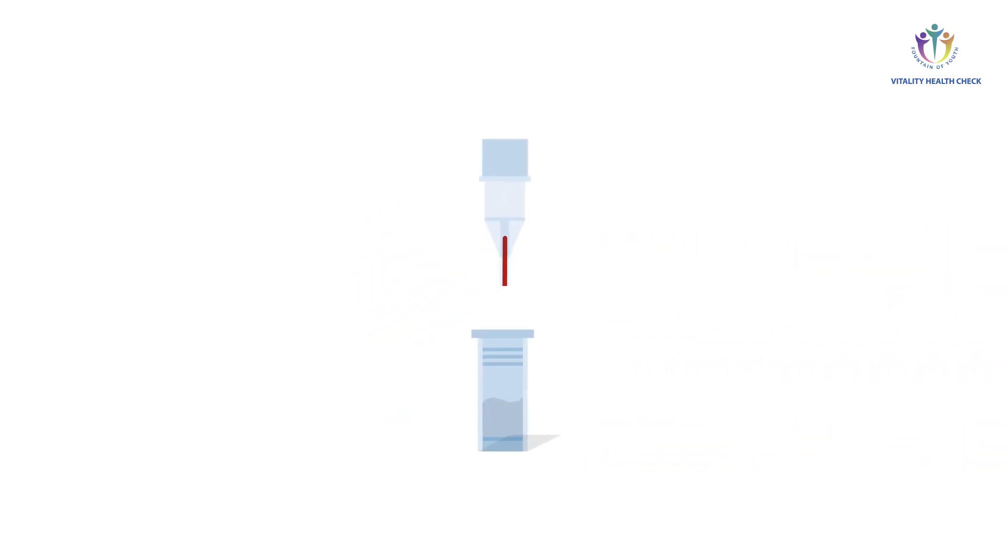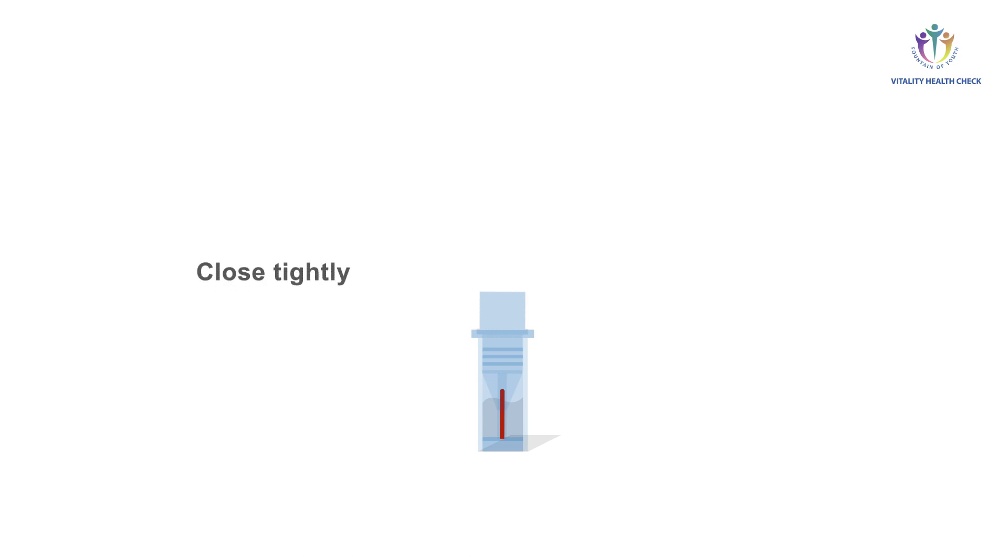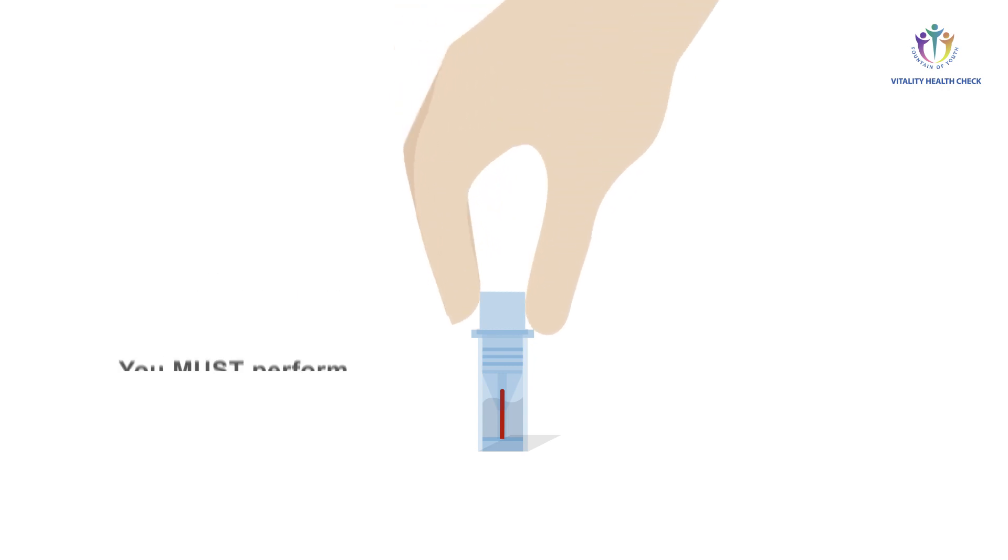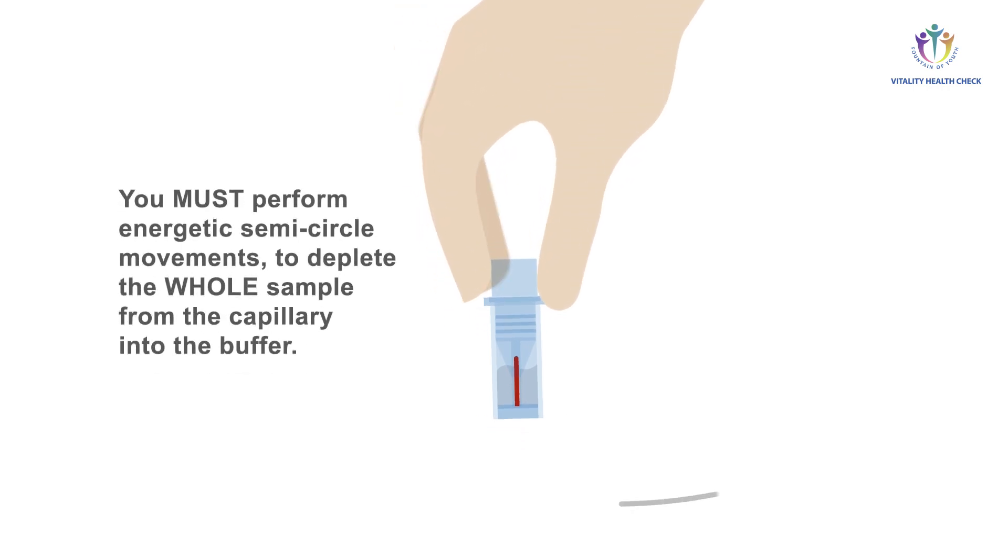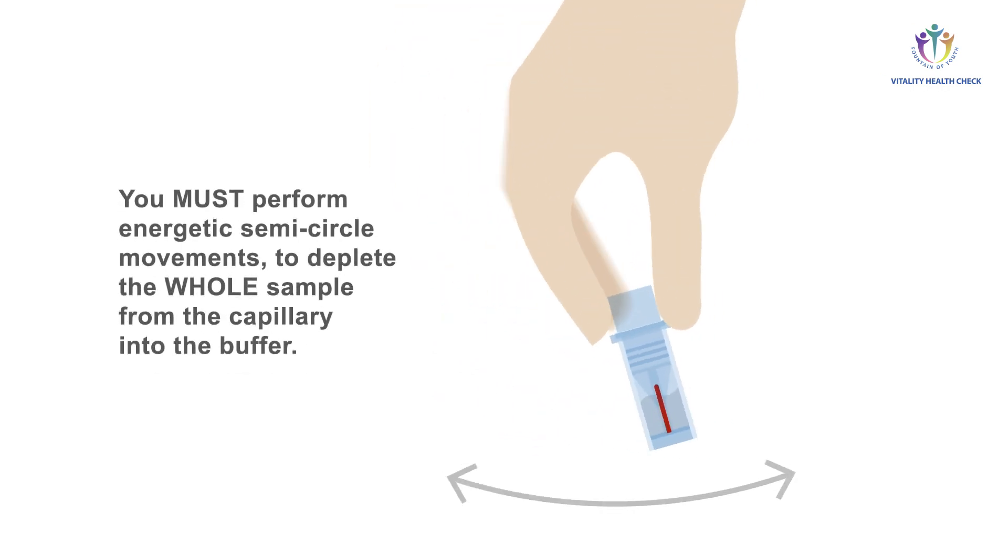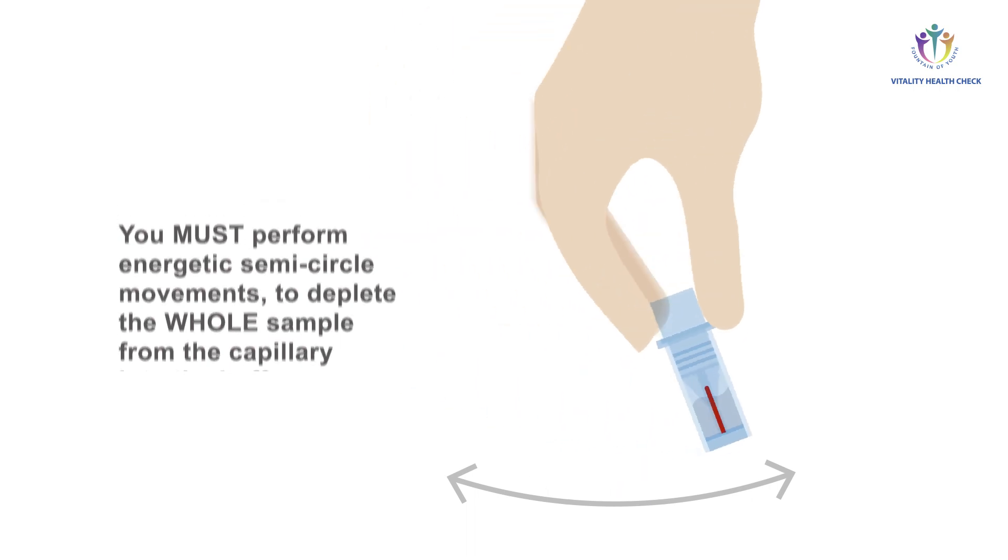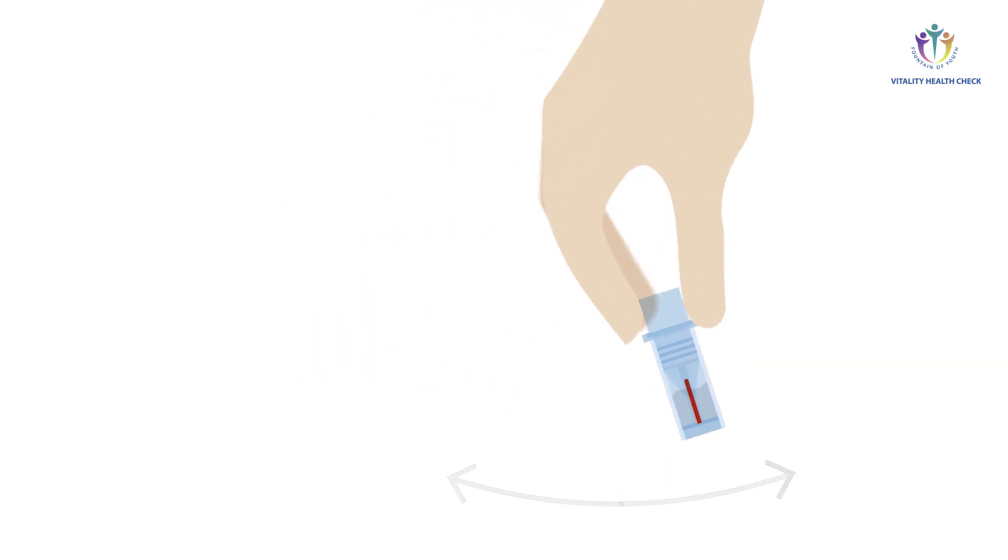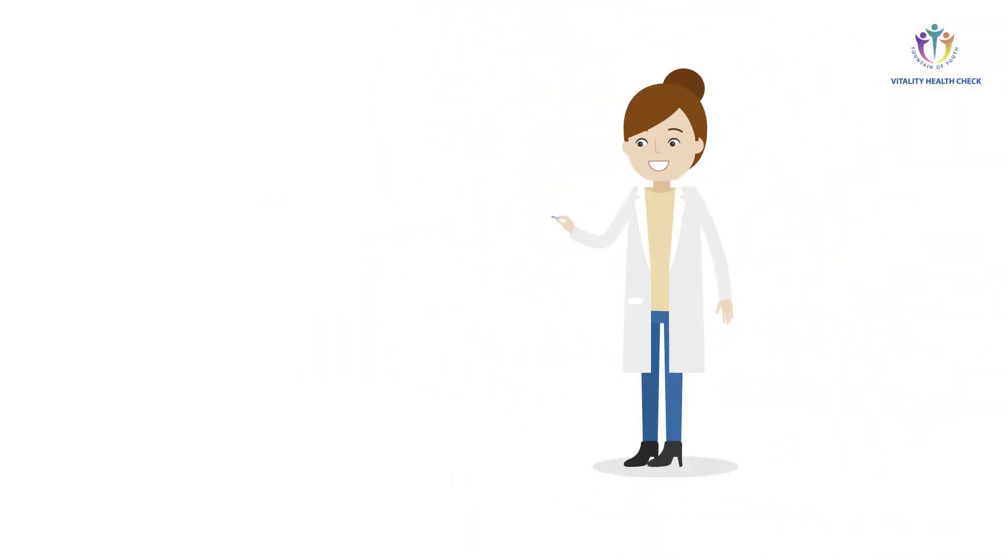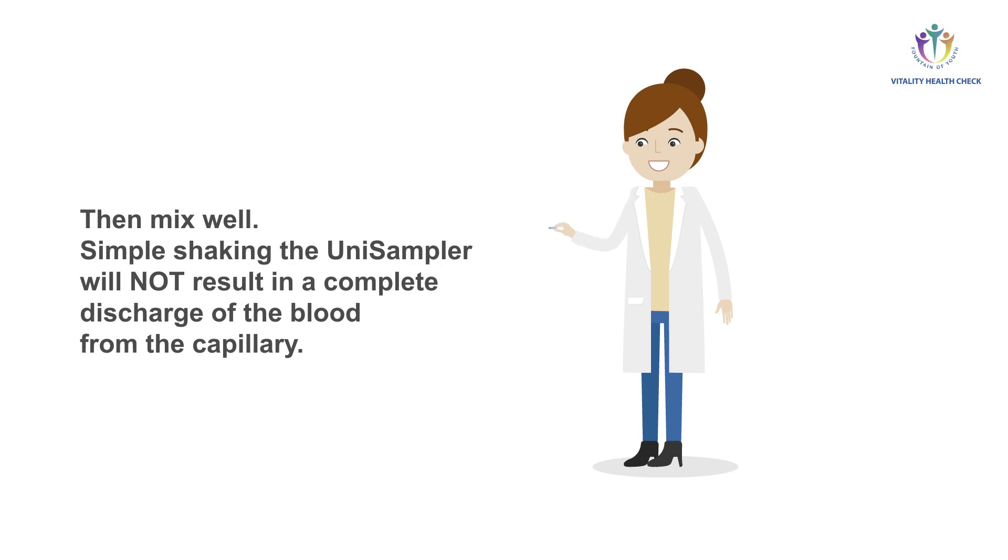Now insert the blood collector with the end-to-end filled capillary onto the prepared collection tube. Make sure the uni-sampler is closed tightly. To deplete the sample from the capillary, you must perform energetic semicircle movements and thus generate a centrifugal force pushing the sample directly into the sample buffer. Then mix well.